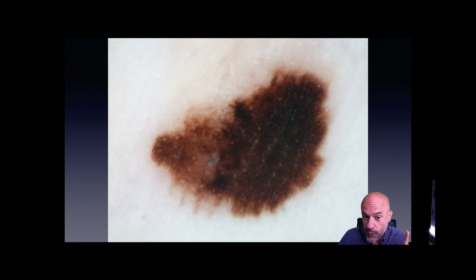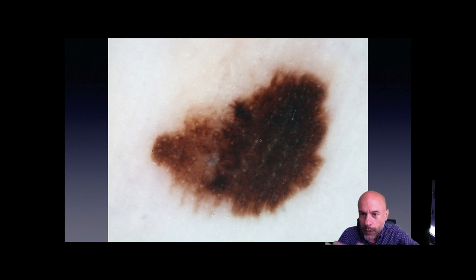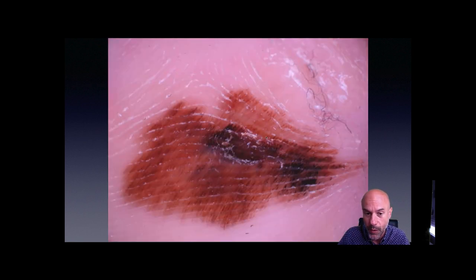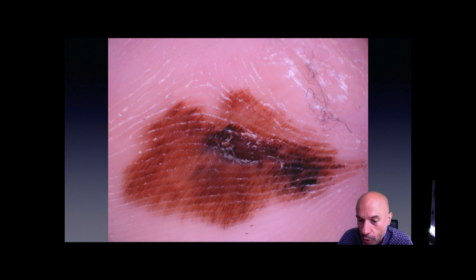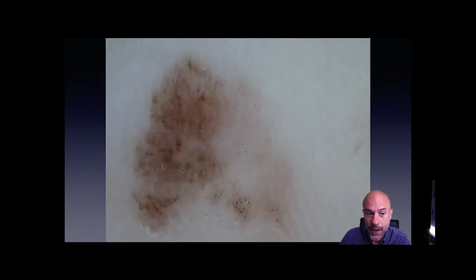Scenario number three is much more interesting. Furrows or ridges? I don't know. Neither furrows nor ridges. Following the peripheral lower part, it looks like the lesion is on the furrows. But if you check the whole surface and ask symmetry or not symmetry, the answer is definitely not symmetric — and this is where you should avoid the trap. The basic rules apply also on acral moles. Or here — fibrillar, yes — but look at the lesion: there is an irregular blotch, an irregularly hyperpigmented area. I cannot ignore it. So here the checklist makes a lot of sense.